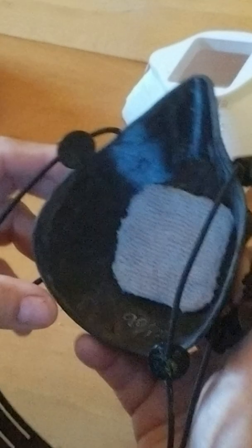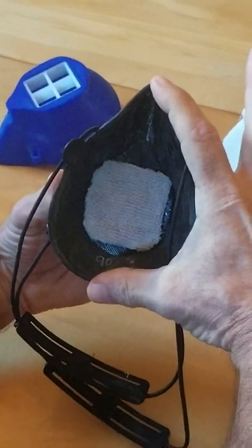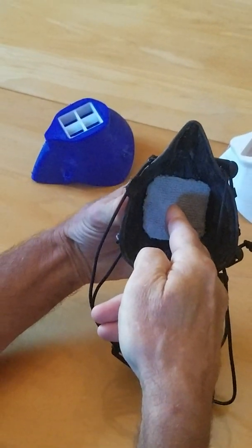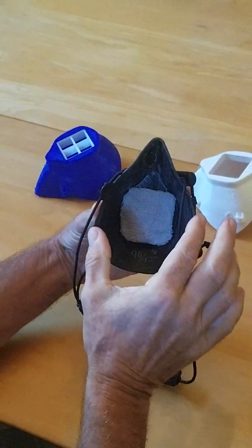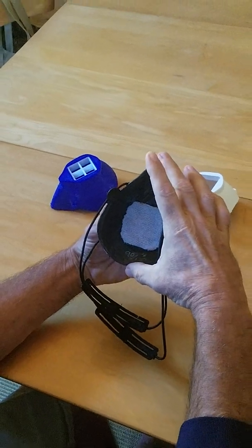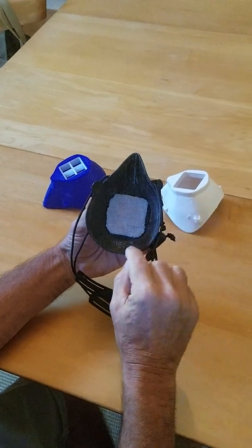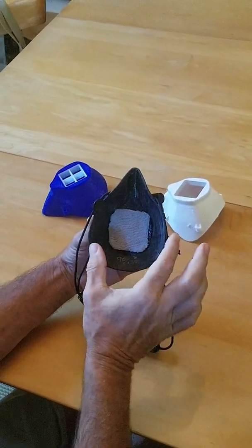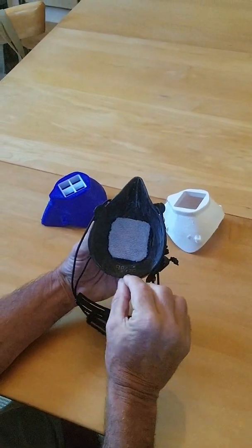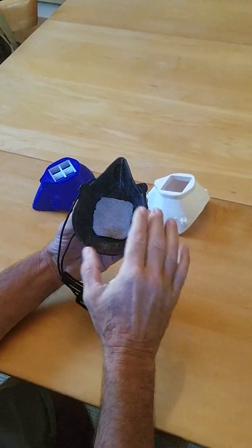Now, in terms of sizing, we would call this the length, we would call this the width, and we would call this the depth. When you get your mask, if you haven't already sized it or tried it out with another mask, you can give us feedback to resize the mask to fit you better. And then we ask that when you receive your resized mask, you make sure the first one you received gets to another health professional, so we keep them going out.